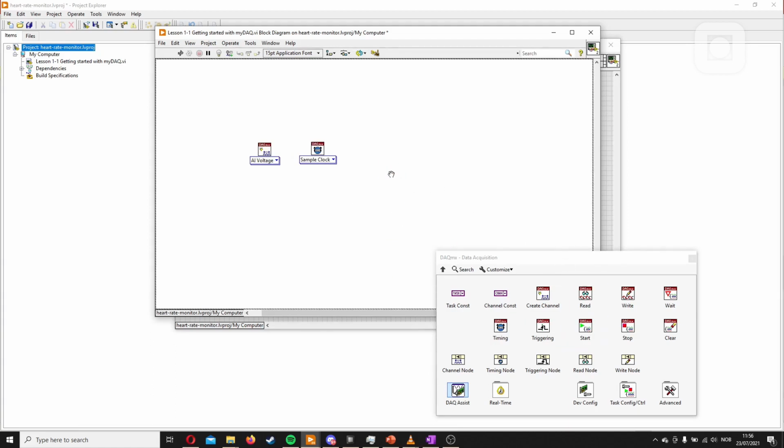And then after we've configured it, we want the readings to start. Then we want to actually get the readings. And when we're done reading, we want to stop the readings. And then at the end, we want to clear the resource so it's not reserved. So at the end of the application, anyone else can use it.